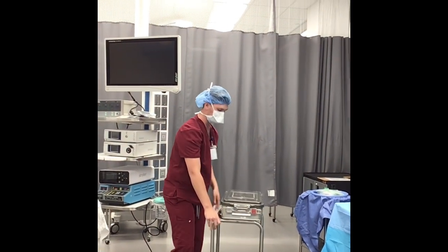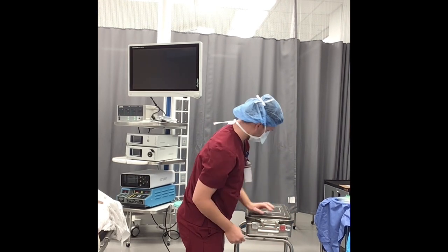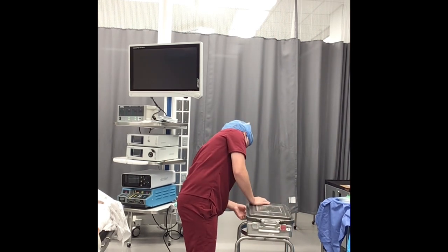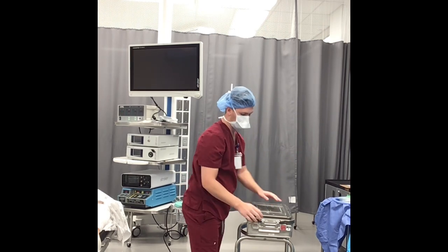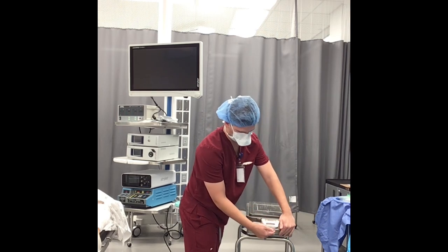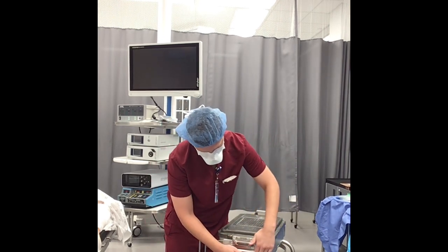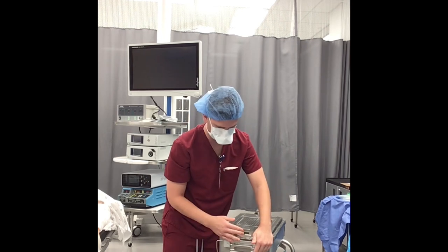Okay. Next thing is my laparotomy set. So I have two external indicators plus my filter. So I'm checking these to make sure they have turned properly black, and then make sure I have a filter up top, which I do. So I'm going to go ahead and pop these. I cover them with one hand and then lift up this bottom lever to release it. I'll show you again on this one. So I'm covering my indicator here and then pulling up on this to release this handle here.